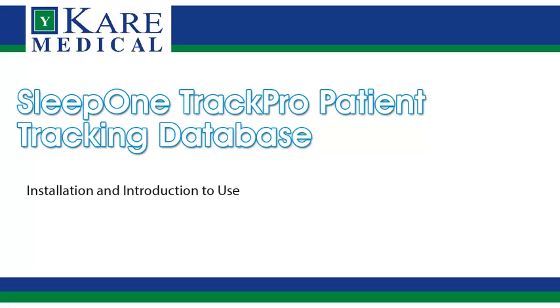Welcome to Sleep One Track Pro Setup and Introduction Guide. Today, I will help you install the software. I will also give you a brief introduction to Sleep One Track Pro.